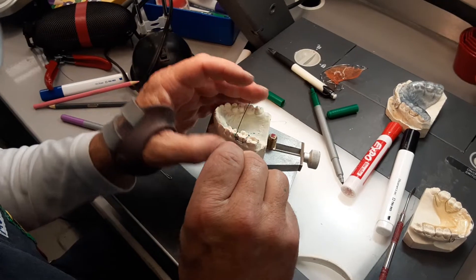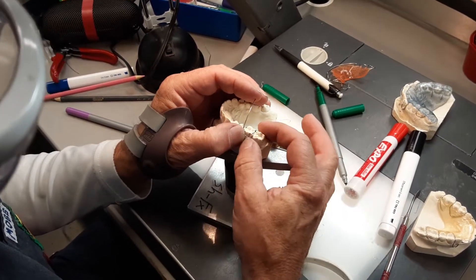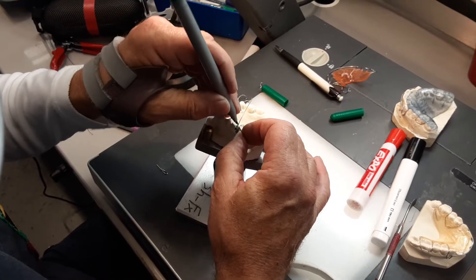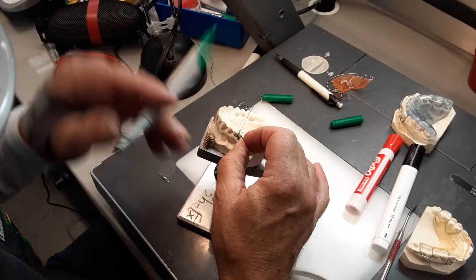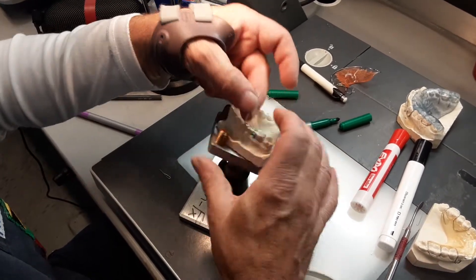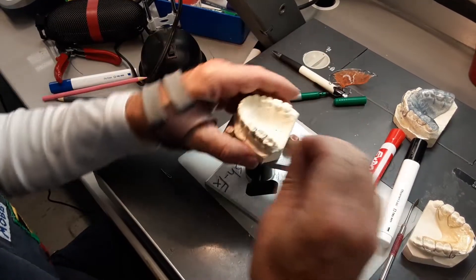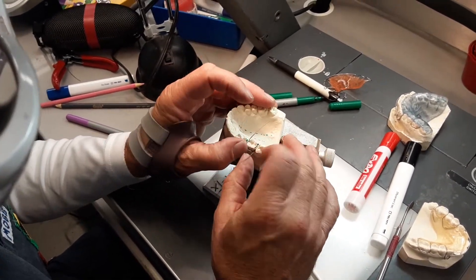I'm going to gently let it sit back like that and I want to see the wire go directly to the embrasure, which it does. So I'm going to mark it where it touches the embrasure, and now I need to bend it down and just a little bit distal. I'm going to grab it at the mark and bend it a little down and a little distal, and then check the fit.